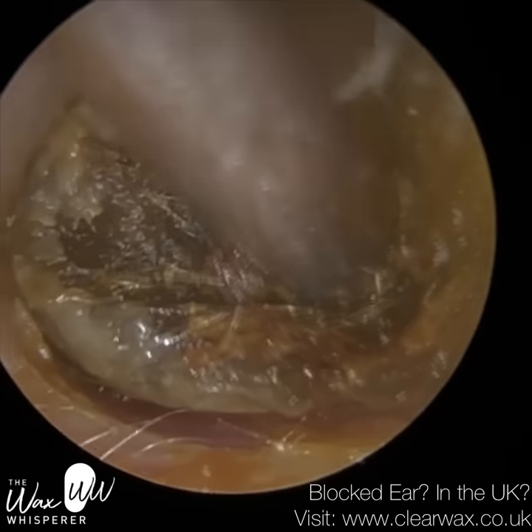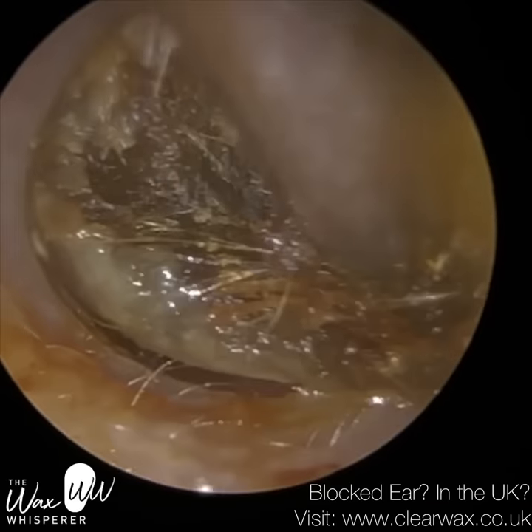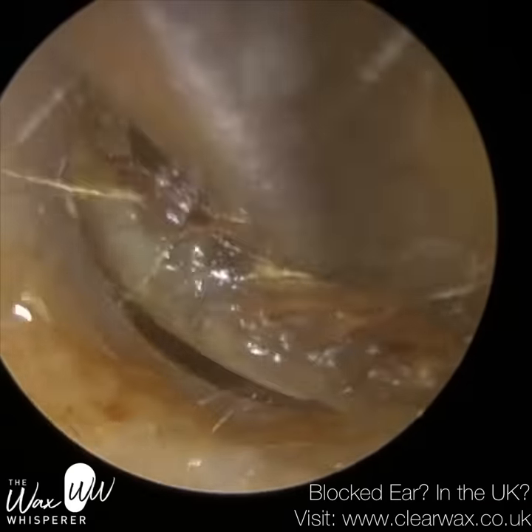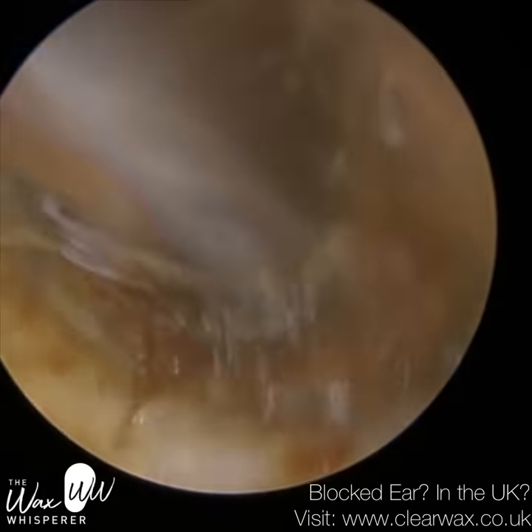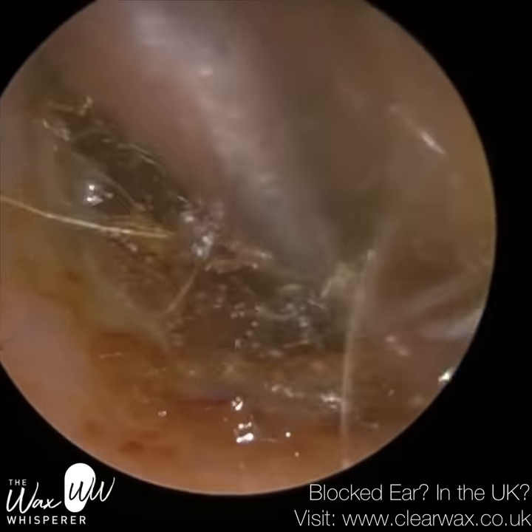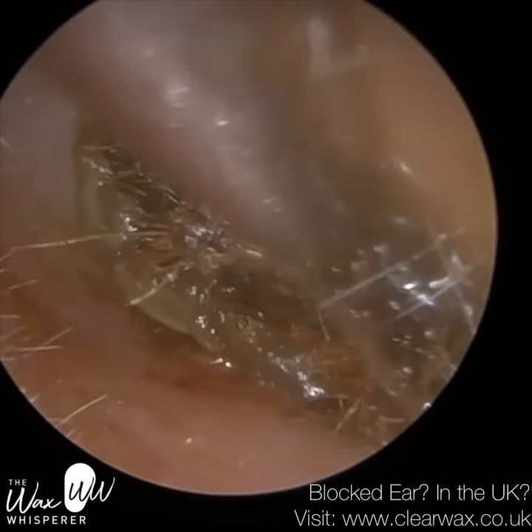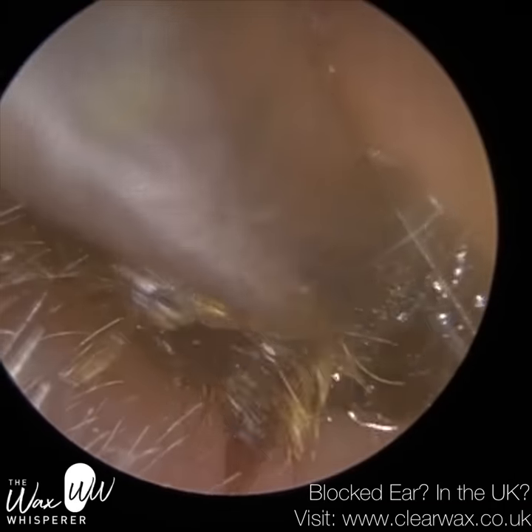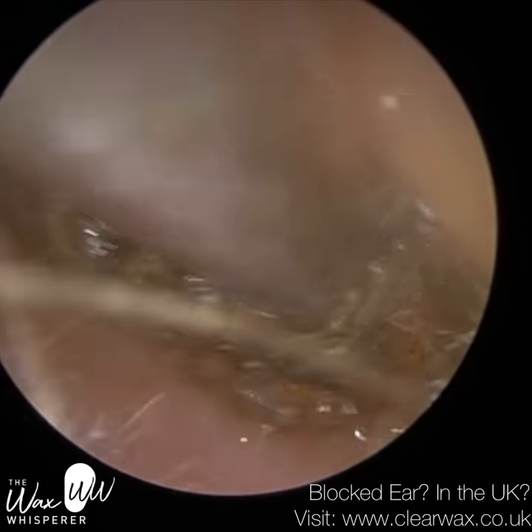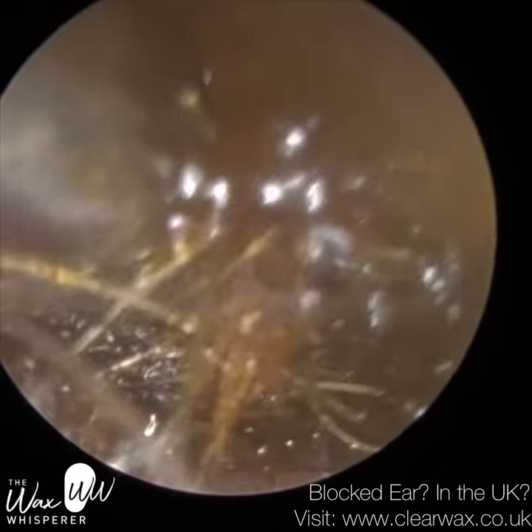Sometimes you can also tell by the color of the canal wall. Just underneath the plug, the ear canal is a bit more red and pink, whereas closer to the tip of the endoscope, it's more pale. Because the skin that lines the cartilage is a lot thicker in comparison to the skin that lines the bony part of the ear canal, the blood vessels are more visible in the inner two thirds because they're nearer the surface. So when you've got blood pumping through, it gives that more pinky red appearance. I'm just trying to manipulate this plug and navigate the bends and twists in the ear canal, and it's almost out of the ear now.